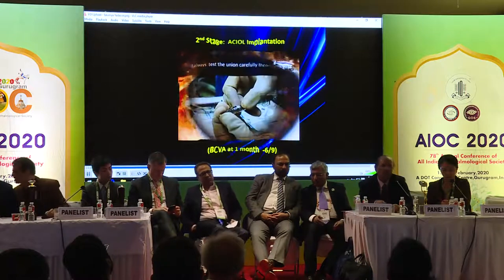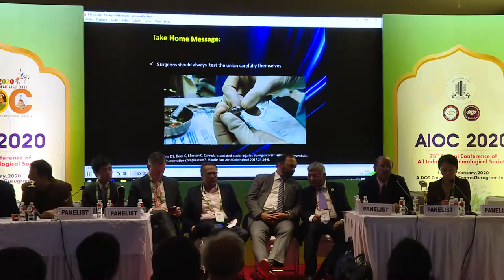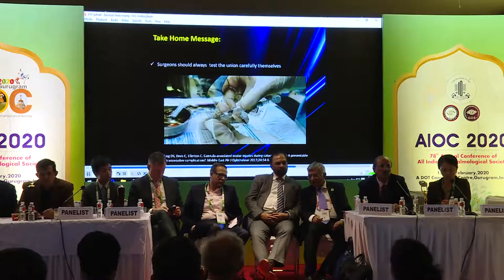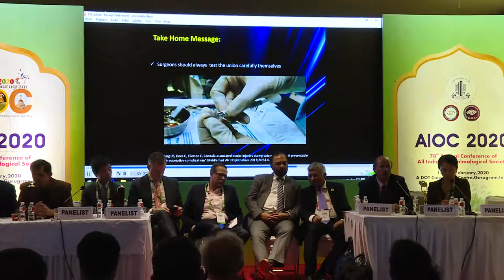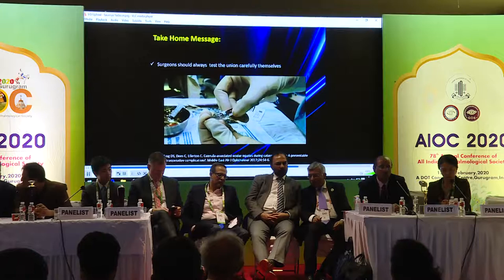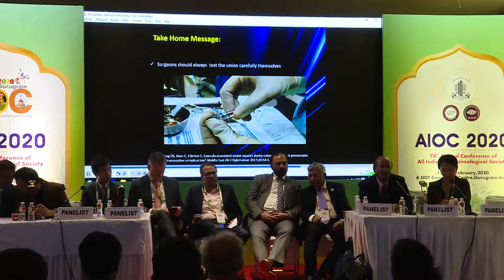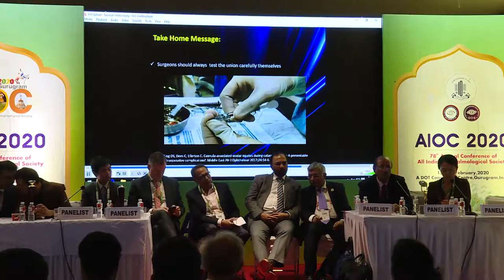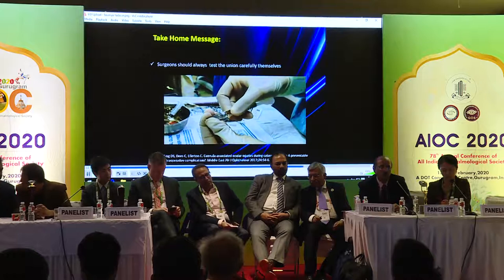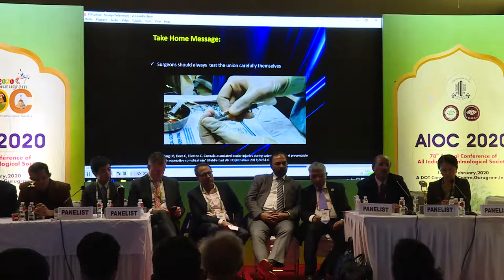Such drastic complications during routine cataract surgeries can easily be prevented by taking simple precautions. Following are the take-home messages from this case. Prior to any intraoperative use, the union of the cannula and the syringe should always be checked by the surgeon themselves.